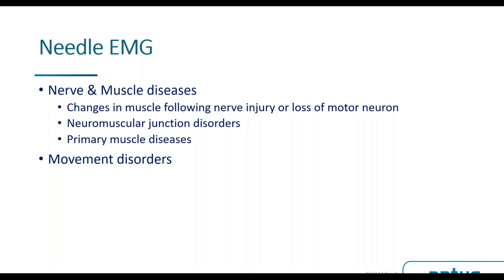We can also use needle EMG to understand muscle contraction and movement disorders. And finally, needle EMG can be used for treatment purposes, for guiding the needle in chemodenervation processes. So needle EMG has a much broader scope. I'm going to focus mainly on the diagnostic part.